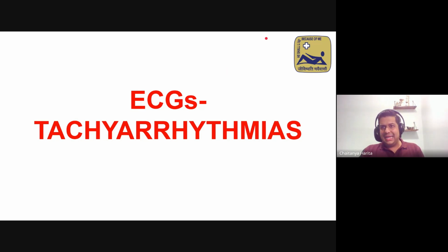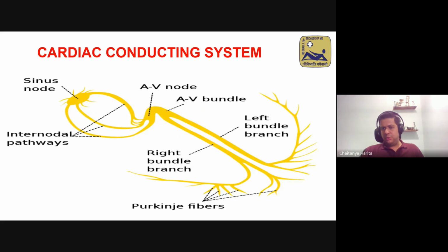So coming to tachyarrhythmias, and this is something I find that everybody sort of struggles with when they make a diagnosis on ECG. So what I have done over time is used a lot of guidelines to build up a sort of algorithm, which I'll show you. A revision of the cardiac conduction system.